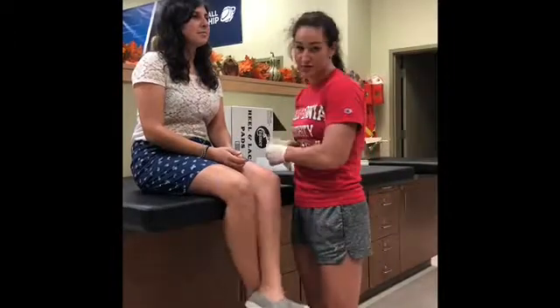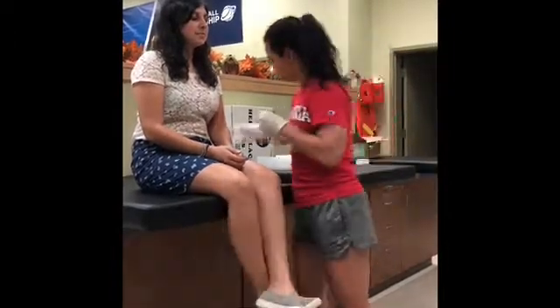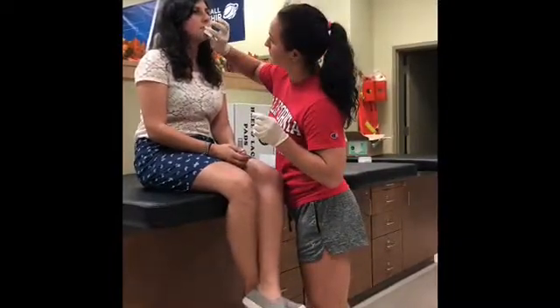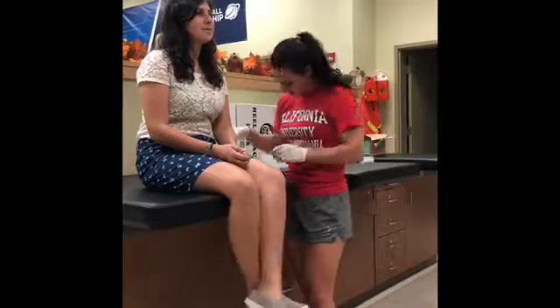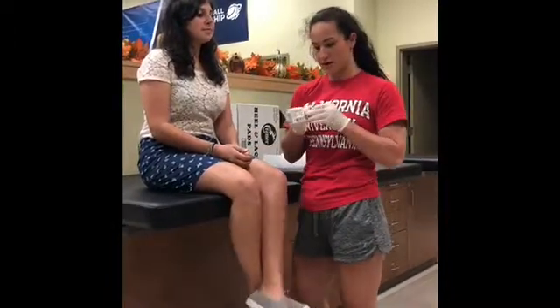Then I'm going to dry the area with sterile gauze, lightly drying it. Now I'm going to open my steri-strips.